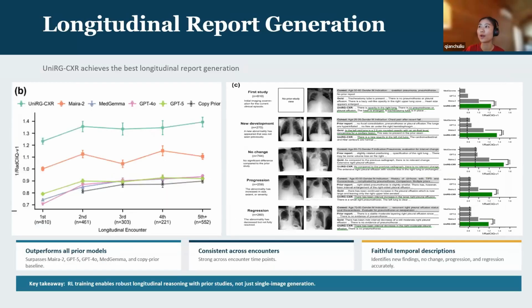Okay. Next, I want to spend some time to talk about the longitudinal report generation capabilities. For the Rex rank leaderboard and for many previous setups for the radiology report generation task, people usually just take the current scan as the input and then ask the model to generate the report accordingly.